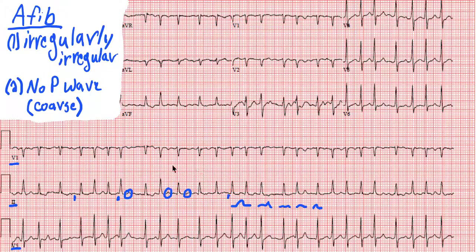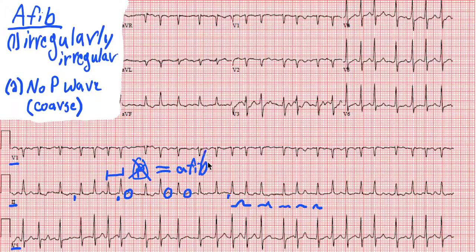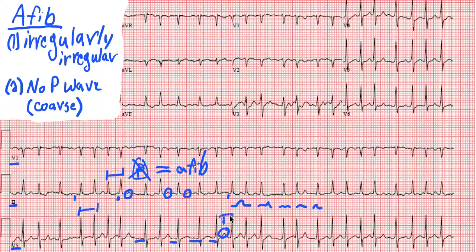But in this patient's case, they have an irregularly irregular rhythm from R-to-R with no discernible P waves, so this patient is in atrial fibrillation. We can look at any of the other leads as well — V5 shows the same thing: irregularly irregular, no good P wave here, here, here, or here. We see T waves, but we don't see any P waves.